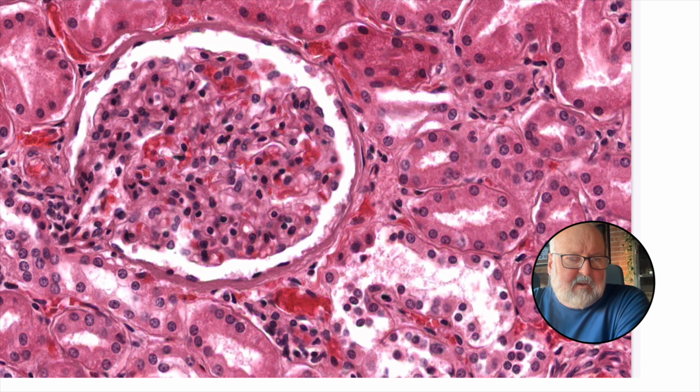Now there's a second type of epithelium here. Have a look around for a second. See if you can see it. Remember, we're looking for a space. So here's a space. You can see that there's a very similar pattern because what we're looking at here are tubes that have been cut across.